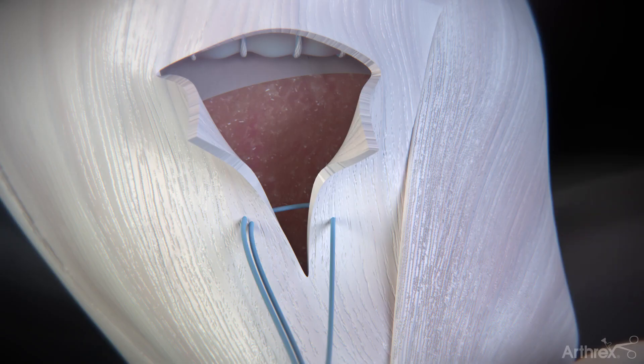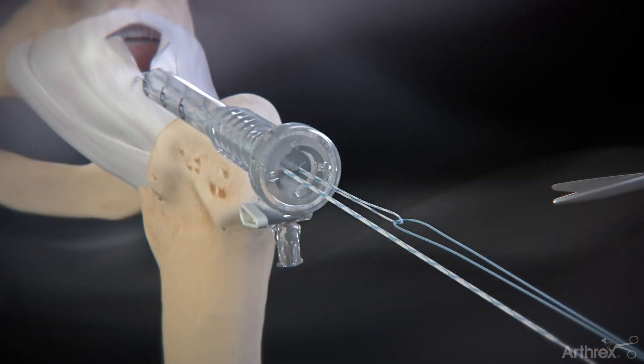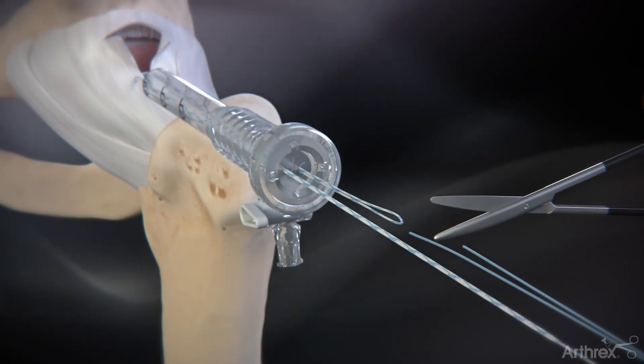After passing the fiberlink suture tail through both limbs of capsule, pull the suture tail until the striped loop-lock suture is outside of the cannula. Cut the loop side of the fiberlink passing suture with fiber wire scissors.